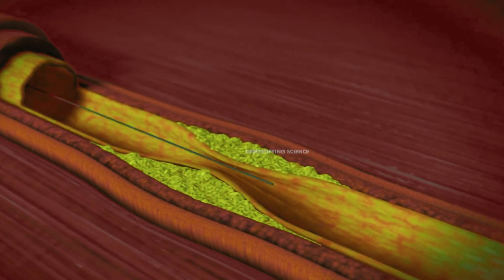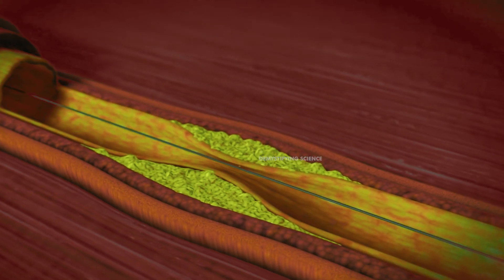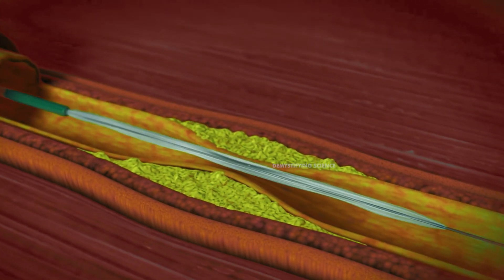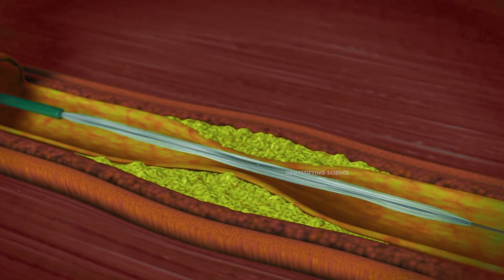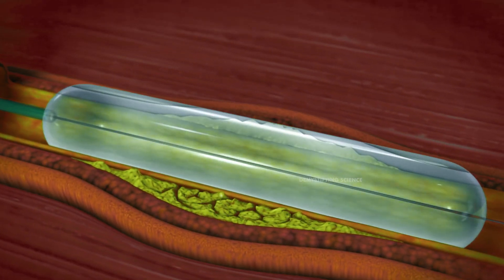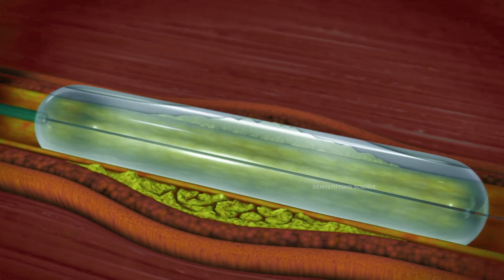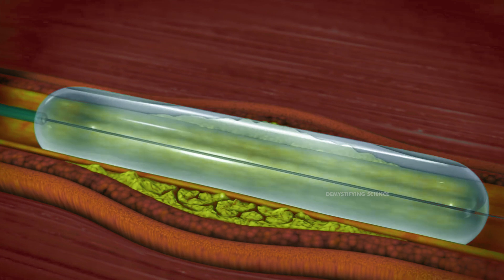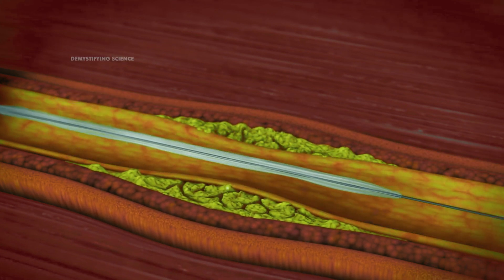Once they locate the blockages, the doctor inserts a second catheter and a guide wire, usually with a balloon at the tip. When the second catheter is in position, the doctor inflates the balloon, by which the fatty deposits or plaque get pushed against the wall of the artery. This clears the way for blood flow.